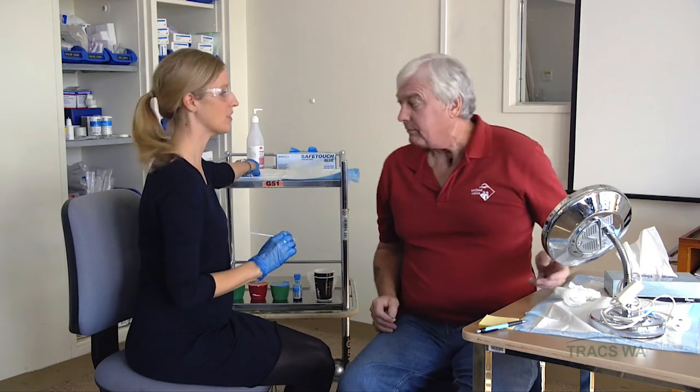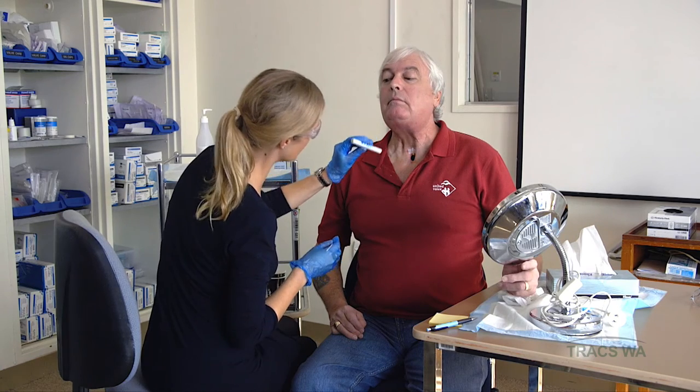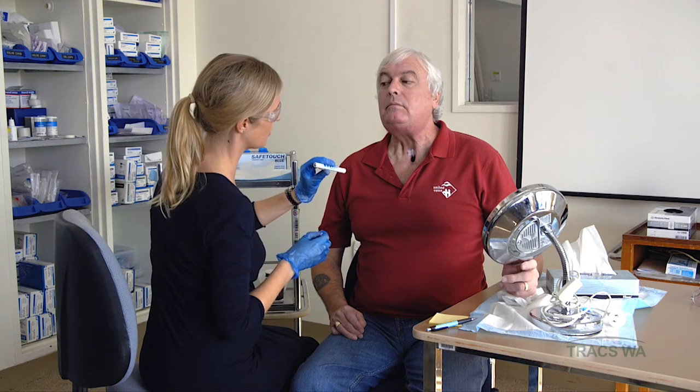While you're here though, we'll just review how to clean the valve because I think that would have done the trick for you. If you just gave it a good clean, we could have saved you a trip in to see the speech pathologist. So I'll just get you to turn around a bit so you can see what I'm doing in the mirror. And because it all looks nice and clean there, we're just going to focus on the centre of the valve, okay?